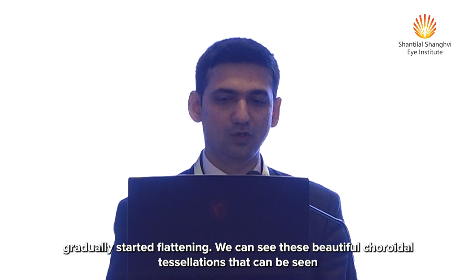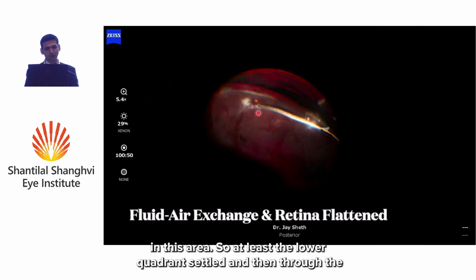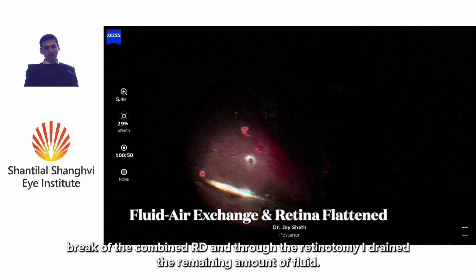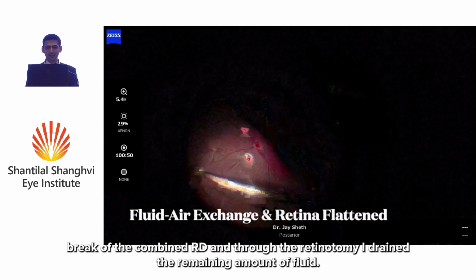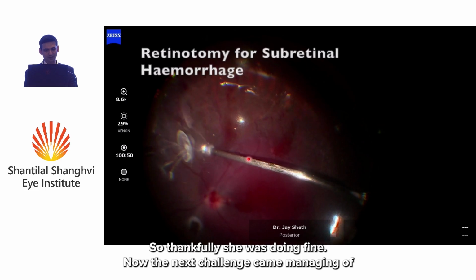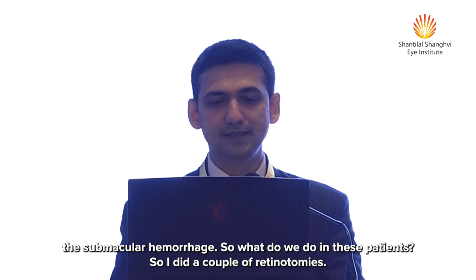We can see these beautiful choroidal tessellations in this area. So at least the lower quadrant settled, and then through the break of the combined RD and through the retinotomy, I drained the remaining amount of fluid. Thankfully she was doing fine. Now the next challenge came: managing the submacular hemorrhage. So what do we do in these patients?